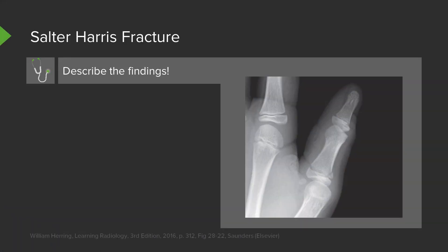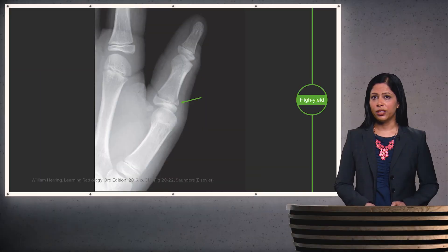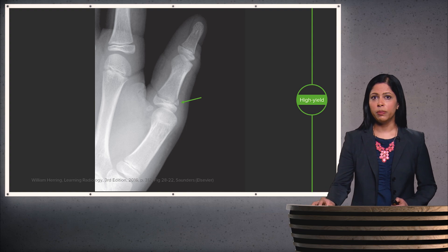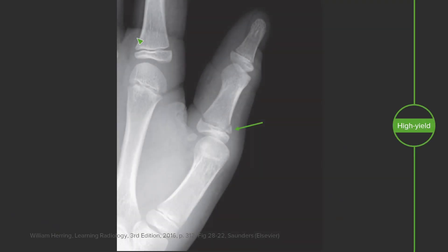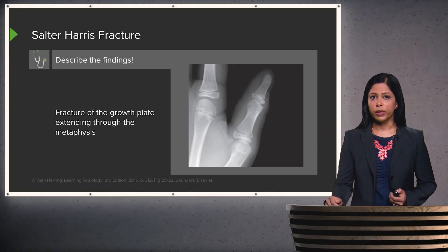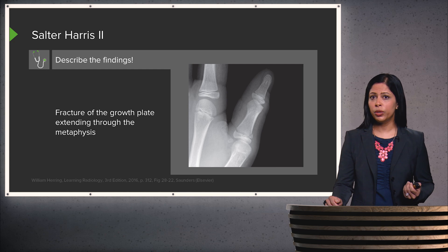Here is an x-ray of the first digit. The arrow points to the fracture. You can tell this is a skeletally immature patient because you can see the growth plates open in these bony structures. The growth plate is visible here, and this is the fracture. This is a fracture of the growth plate that extends through the metaphysis — a Salter-Harris type II fracture, which tends to have a pretty good prognosis and is the most common of the Salter-Harris fractures.